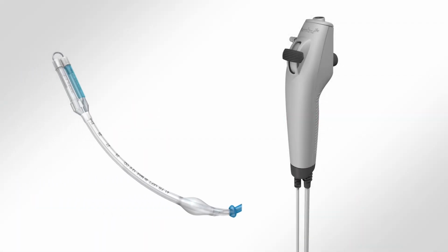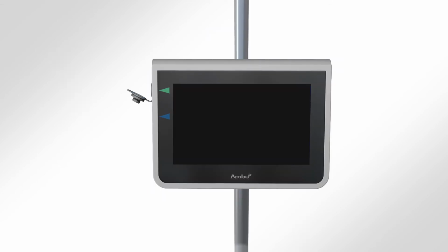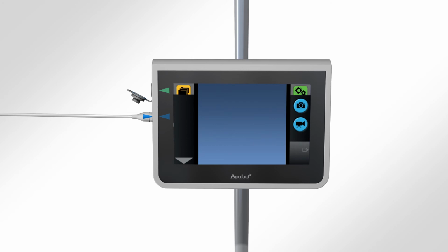The aScope 4 Broncho Slim can be used to assist in placement of double lumen tubes 35 French and up, as well as the placement of bronchial blockers in single lumen tubes 7.5 mm and larger. To use the aScope to assist in double lumen tube placement, connect the aScope 4 Slim to the monitor, lubricate, and select the appropriate size DLT for the procedure.